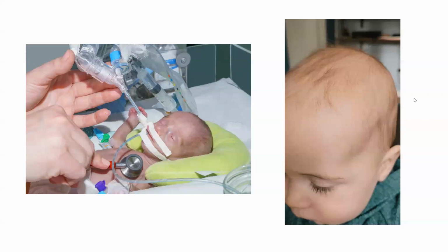And as babies grow older, on the right hand side we've got an infant who's 6 months. What kind of frequency do you want to use over here? Lower frequency, deeper penetration, 5. I see. Okay, and this is really important: you might start with a frequency of 5, and from your perspective, you might want to go up to 6, depending on how your penetration is.